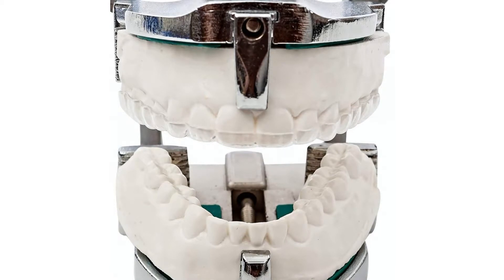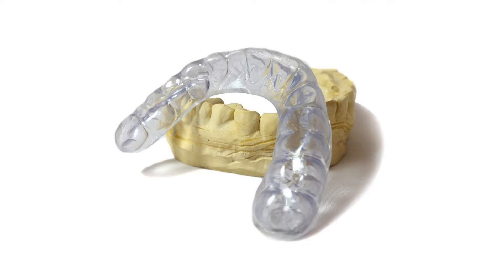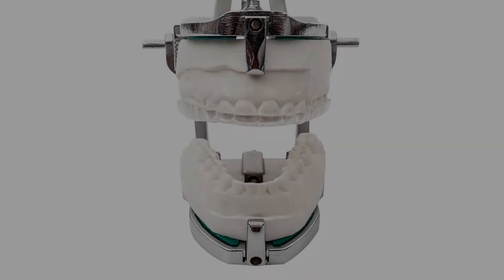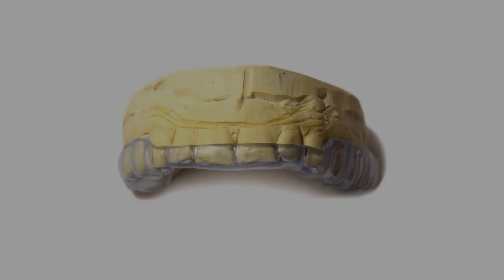Please also note everything about our guard is customizable, including the thickness and the material used. Whether you want a soft, hybrid, or hard guard, or a thinner or thicker guard, we can customize it just for you completely free of charge.